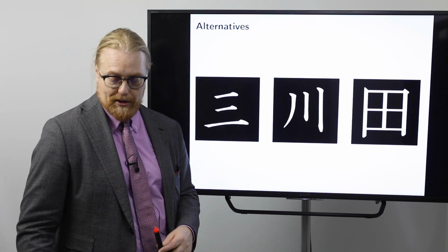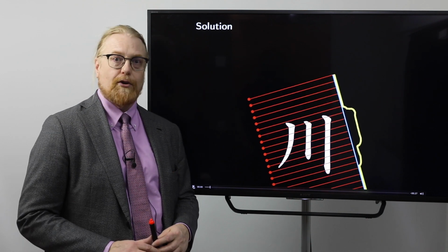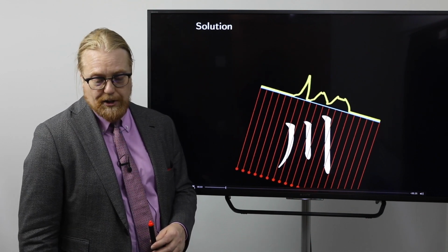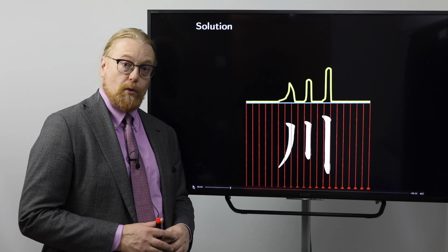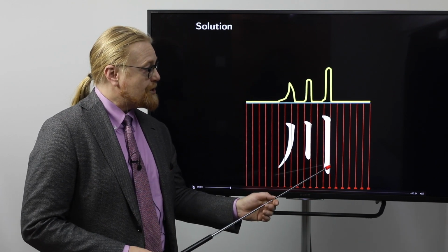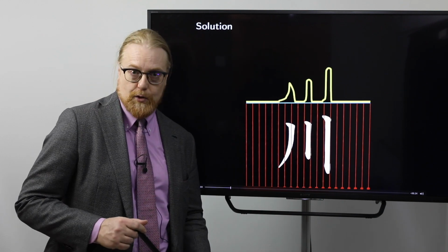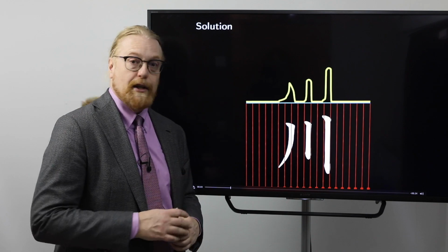And now I'll go to the solution, which is river. And maybe one of the main directions is to look at how it looks directly vertical, so you can see that in that situation there are the longest possible routes for X-rays to travel inside the white material.